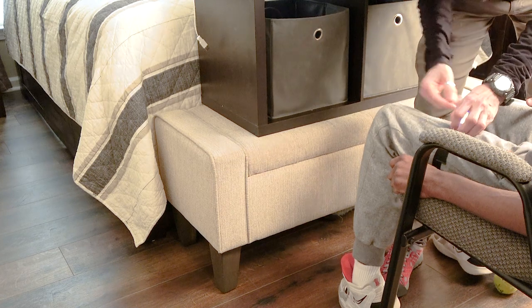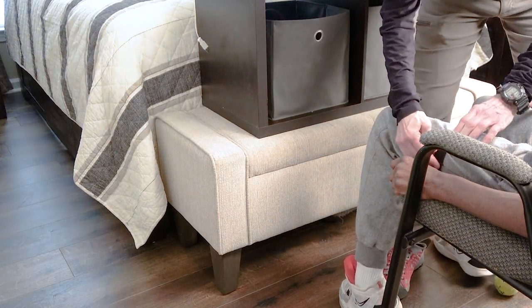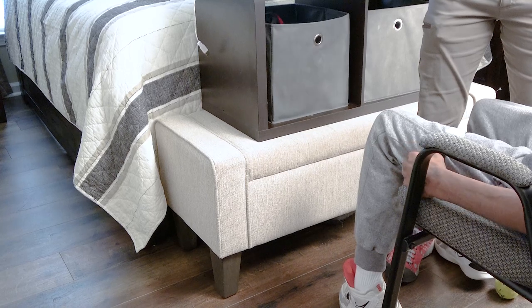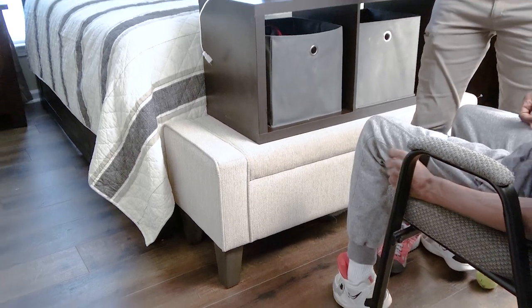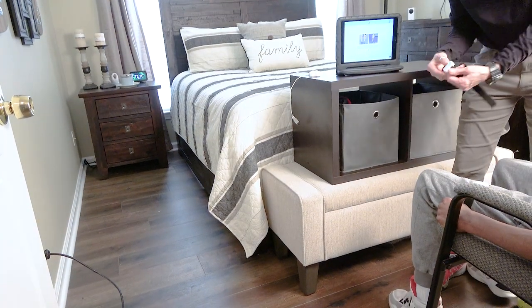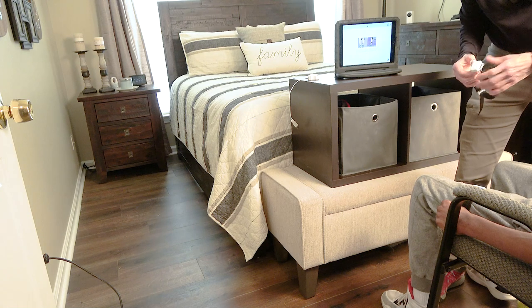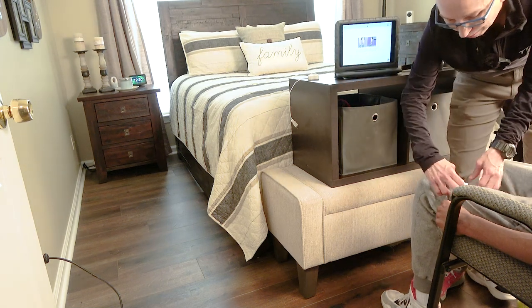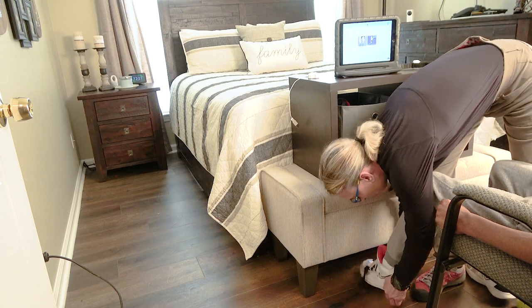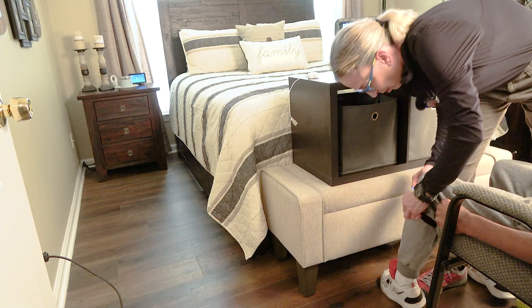I'm going to pull that tight. You need to make sure that wherever you put these sensors — I've got it mid-thigh on him — that it's somewhere it can stay and not move, because if they move after you go past the screen, the gameplay starts to be fairly wonky and doesn't work. The next one goes on the lower leg, and again there is a green light that's asymmetrically placed. You want to make sure it is down. I notice I put this one on upside down, so I'm going to fix it quickly. These are the kind of errors that if you don't get them right, the gameplay is going to look like the game isn't working.